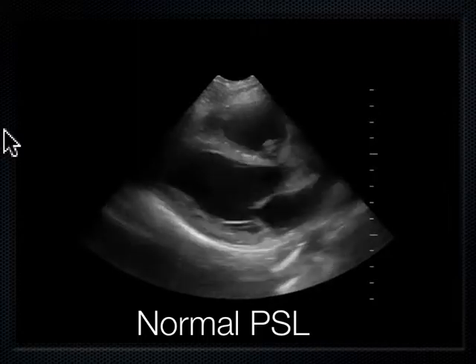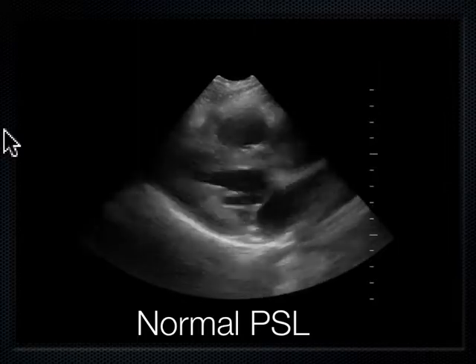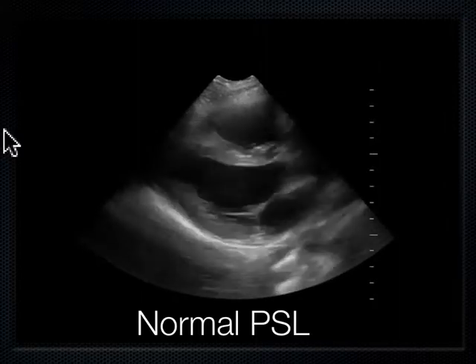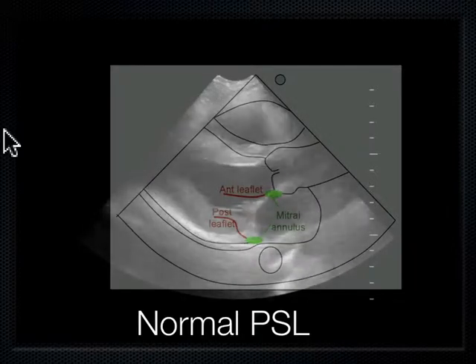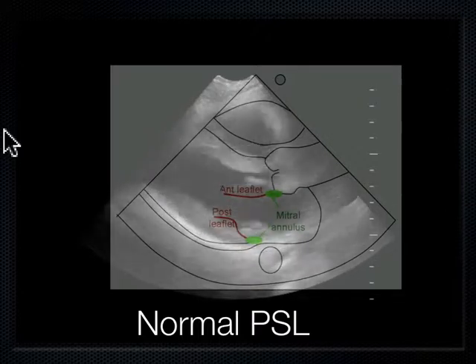And those patients, you've got to be very gingerly with the fluids, and you want to give them another type of medication to help their heart contract better, an inotropic medication. One example is dobutamine. Now, this is just a schematic diagram laid over the parasternal long axis to show you kind of where the chambers are, where the leaflets are, and the idea there.